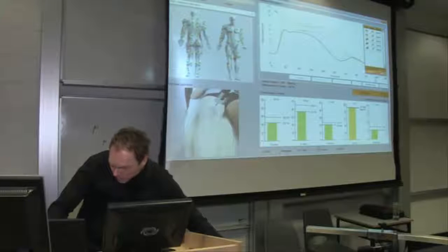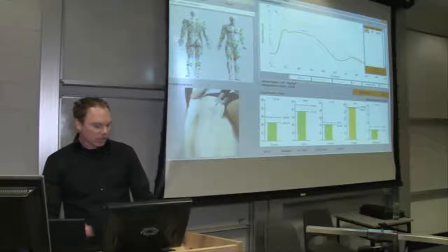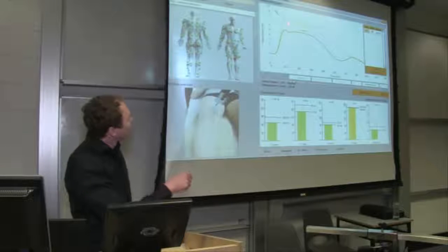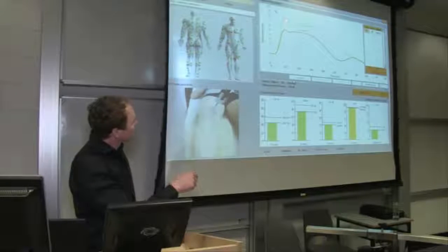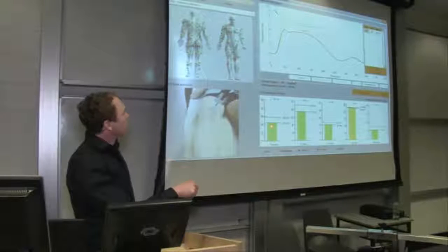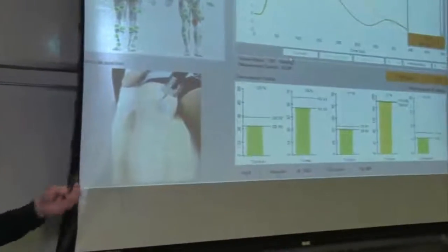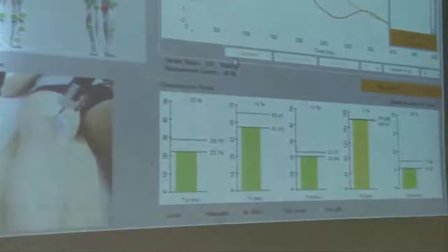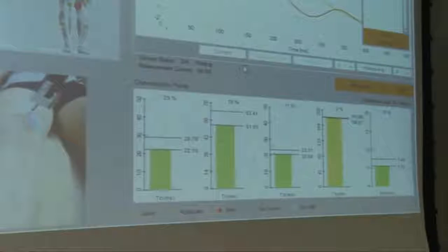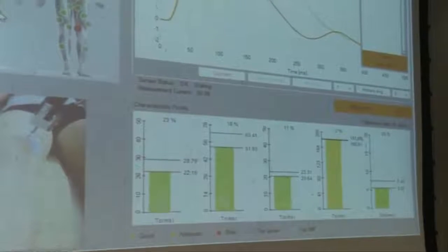Okay. So what you can see here is there is a difference in muscle tonus, but the speed is almost identical. So overall symmetry will still be fine, but the lateral symmetry from the displacement point of view will be just right on the edge. We'll see that when we generate the report. Now we'll switch to the right biceps femoris.